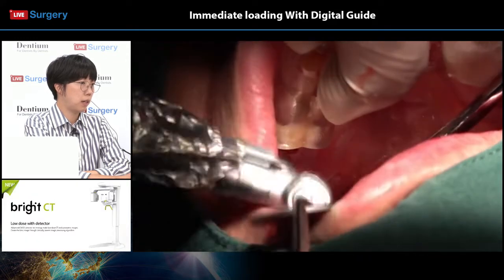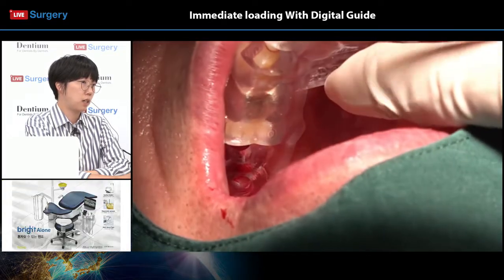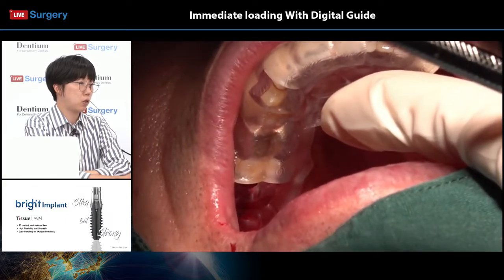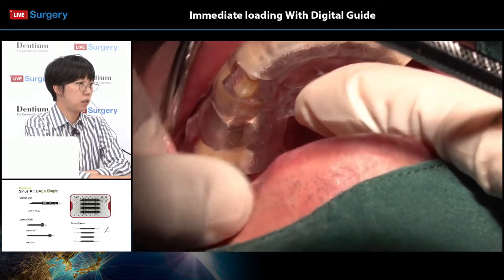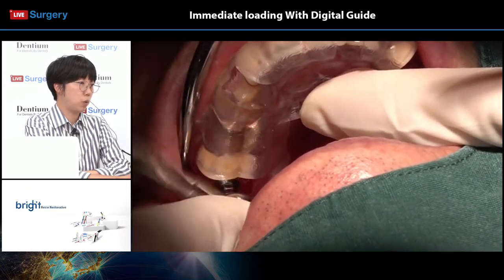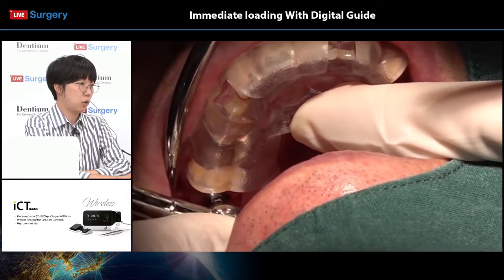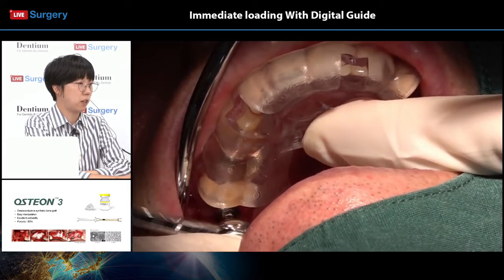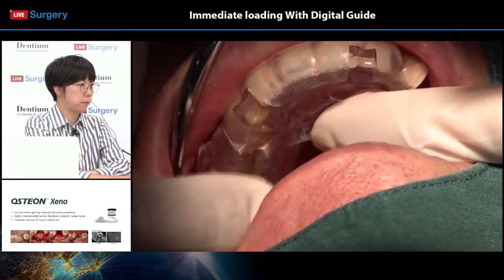The torque and RPM for implant placement or drilling can be a little different from surgeon to surgeon, depending on his or her convenience, but usually there is a recommended RPM and torque for implant placement. So I suggest you follow these instructions first, then make modifications according to your preferences.